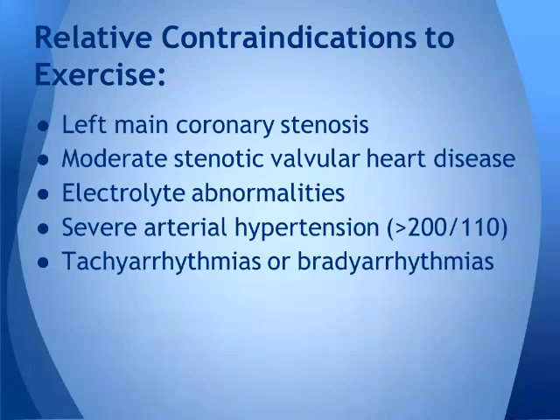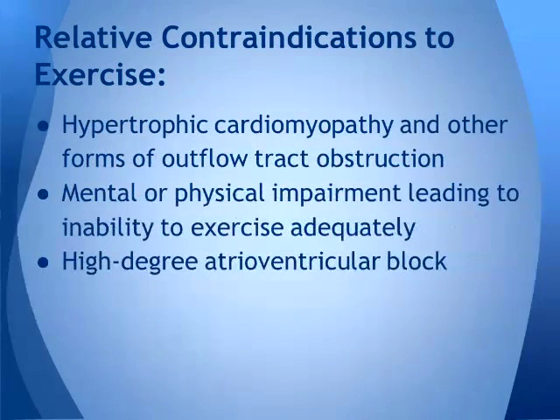So an exercise test in a patient who needs beta blockade or calcium channel blocker for rate control might not be the best test. Lexiscanning those patients is a better idea. Other relative contraindications: hypertrophic cardiomyopathy, mental or physical impairment leading to inability to exercise, high degree AV block.